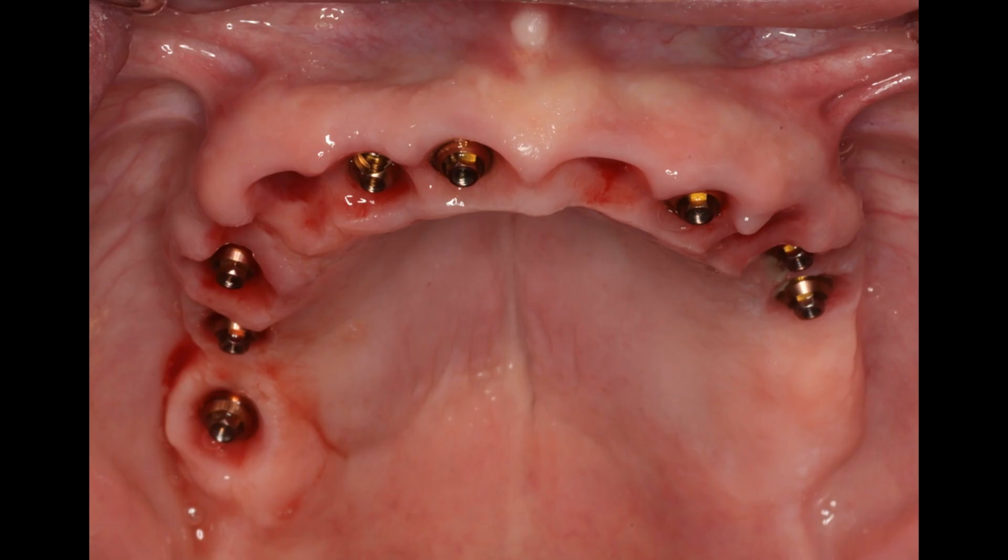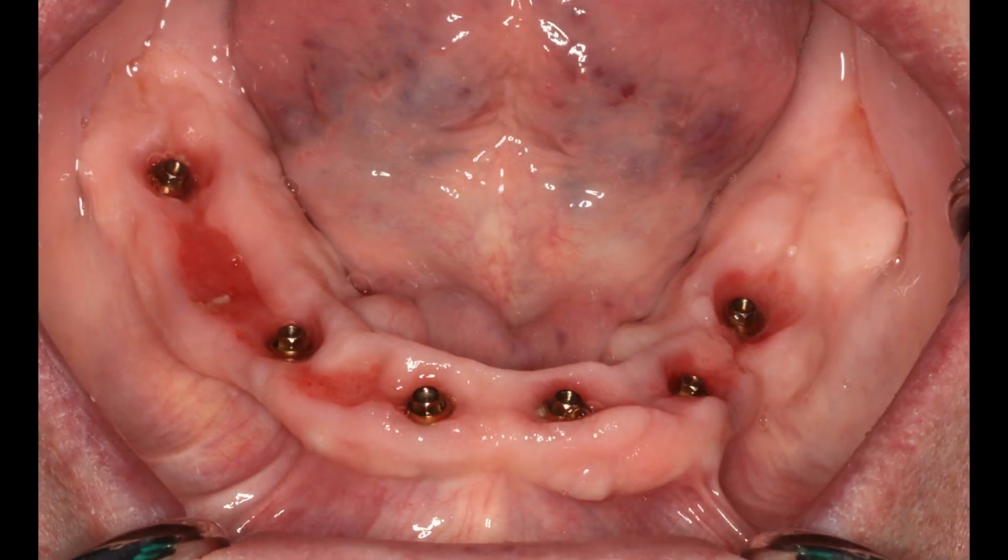But anyway, notice the papilla in this gentleman's case. I'd say we were probably at 70 to 80, maybe even higher than that percent of maintaining that little triangular piece of tissue between the teeth called the papilla. And the lower soft tissue is also outstanding. Lots of volume, and the only red spots are where the acrylic resin was touching his gum tissues.